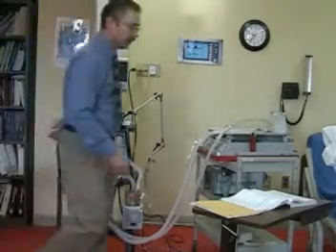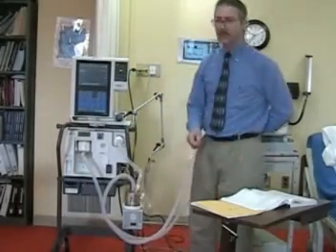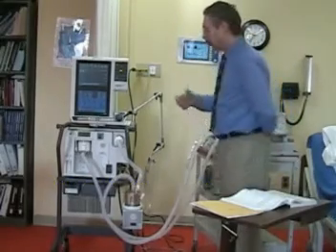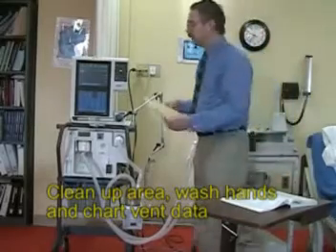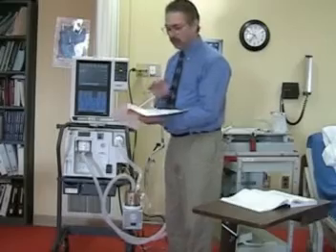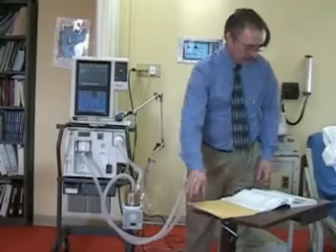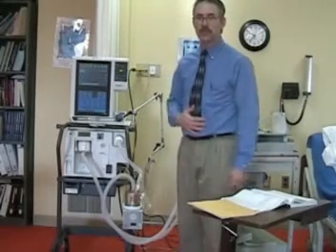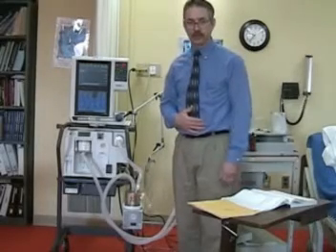And then we'll want to draw arterial blood gases within a half hour after setup. We're going to clean up our area, wash our hands, and then before we leave the patient, we want to chart all of the information in the patient's ventilator record. That completes the initiation performance on the 840 Puritan Bennett ventilator. Thank you.